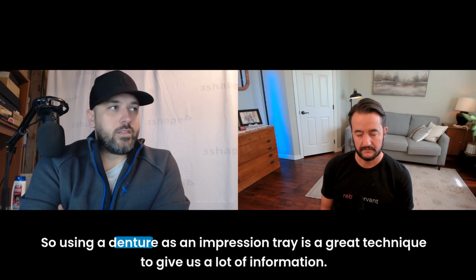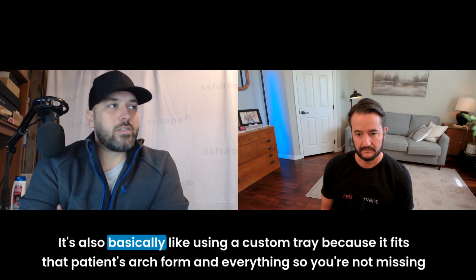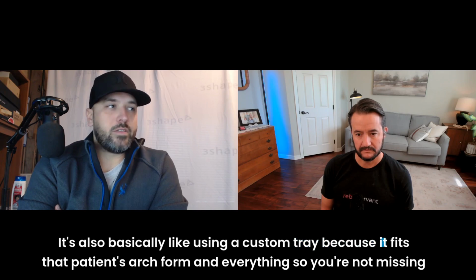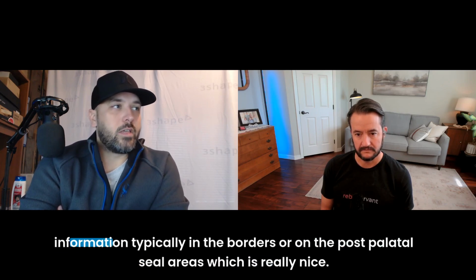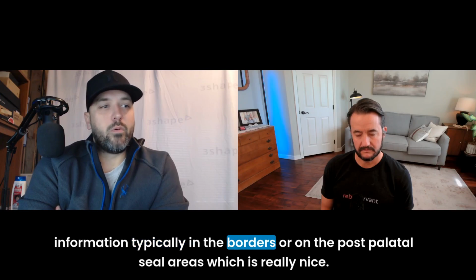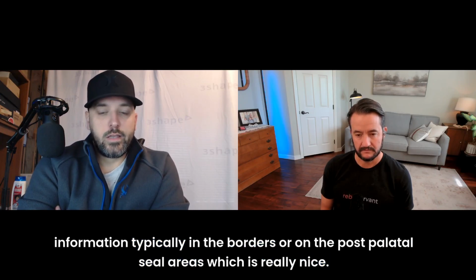So using a denture as an impression tray is a great technique to give us a lot of information. It's also basically like using a custom tray because it fits that patient's arch form and everything, so you're not typically missing information in the borders or on the post-palatal seal areas, which is really nice.